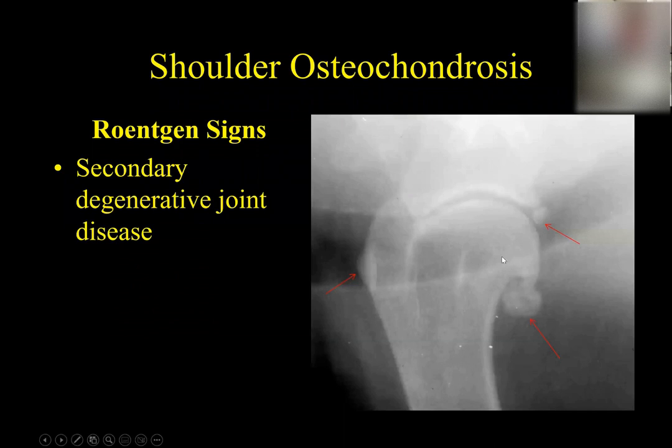If you leave it alone and don't do anything about it, then over time that area will fill in with bone. It's not normal bone, but it will fill in, but you get a lot of arthritis. Now you start to get mineralized opacities on the infraglenoid tubercle, large bulbous mineralized opacities on the distal end of the caudal humeral head.